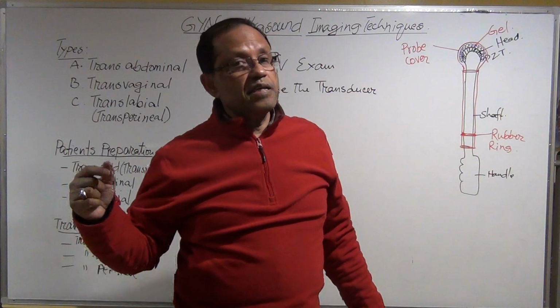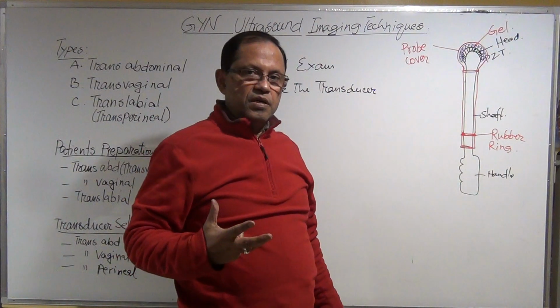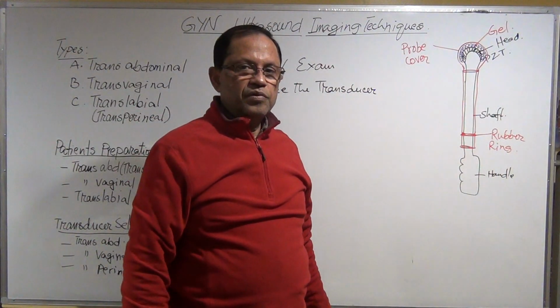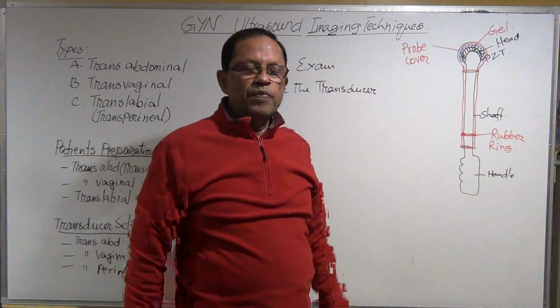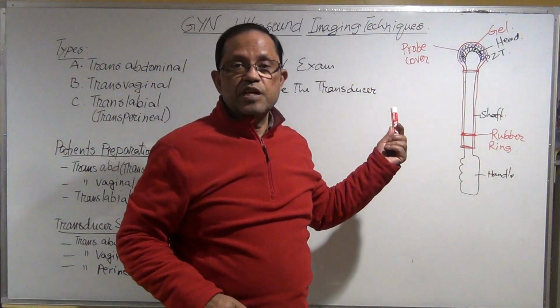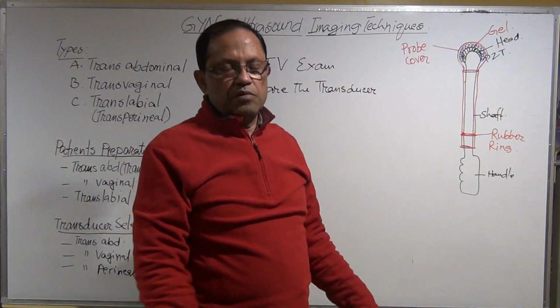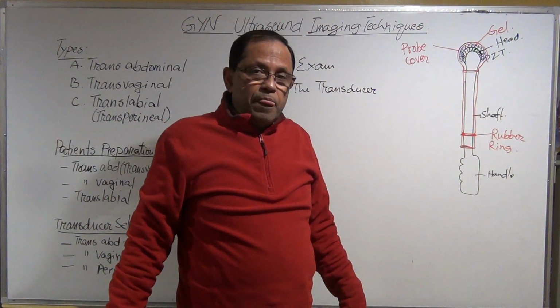If the patient feels any discomfort, agony, pain, burning, you can take it off. If the patient says, no, I don't want that, you can take it off. But make sure you explain it very nicely to the patient if it is the first time. If it is the second time, third time, the patient knows, oh, I know how I'm going to feel it.